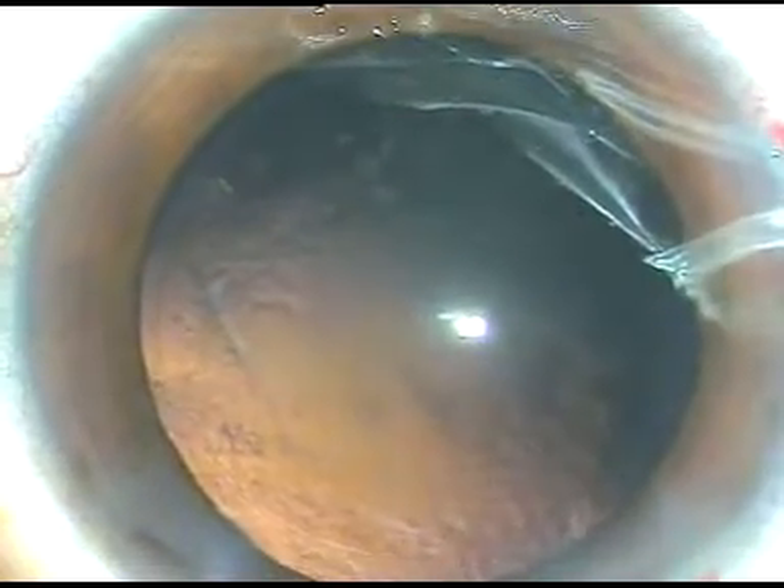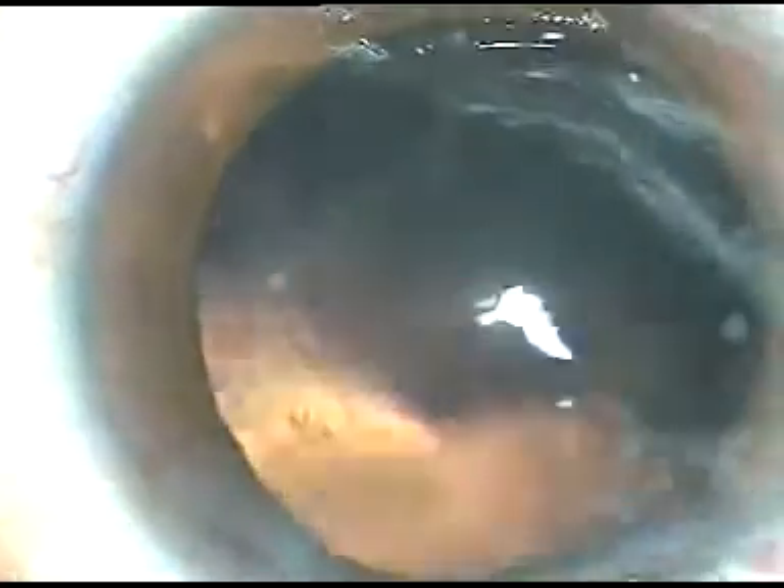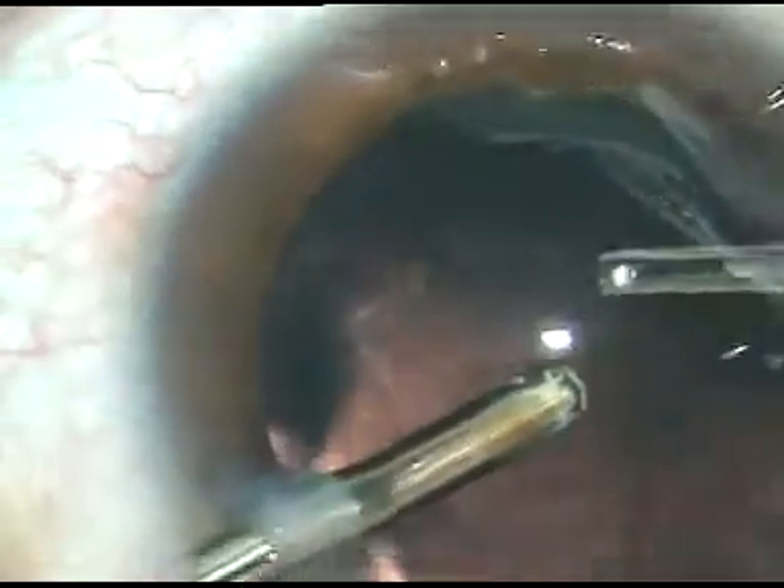In this case, I can see there are a lot of cells sticking to the posterior capsule. If I try to pinch and release the posterior capsule, once in a while I can make a small PC rent. So nowadays, what I do is take the irrigating probe of the bi-manual, and this jet of fluid is applied to polish the posterior capsule. The posterior capsule is being irrigated and all the cells get dislodged. I can see some more cells at 11 o'clock, so I use the same jet of fluid from the irrigating probe to dislodge those cells. A very nice polishing of the posterior capsule has occurred.